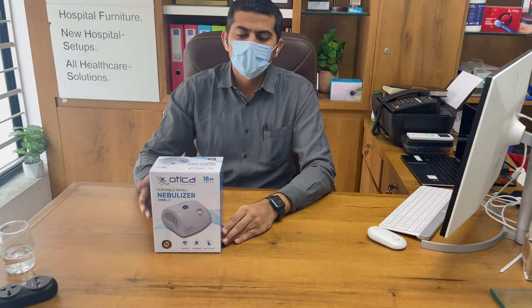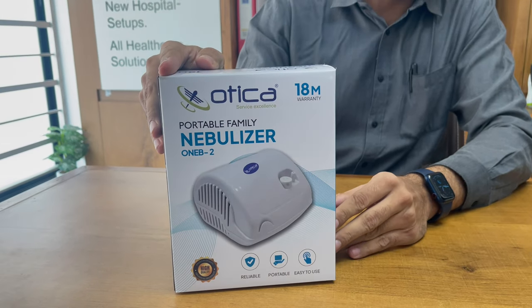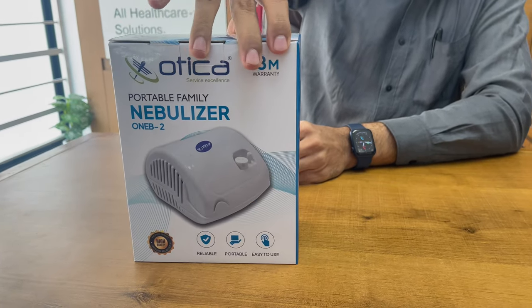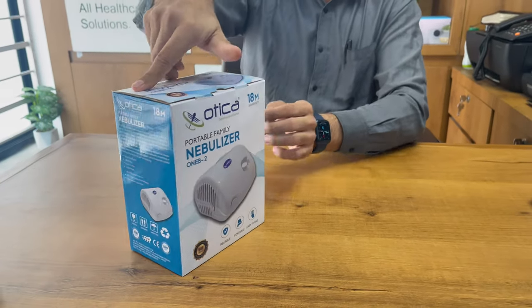Hello friends, welcome to Otika Many Products Company. Today we are going to demonstrate how to use the Otika portable family nebulizer. This is a very compact family-use nebulizer designed and developed by Otika. The machine comes with 18 months of warranty, and this is how it looks.